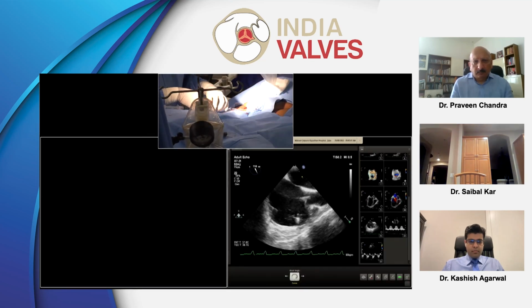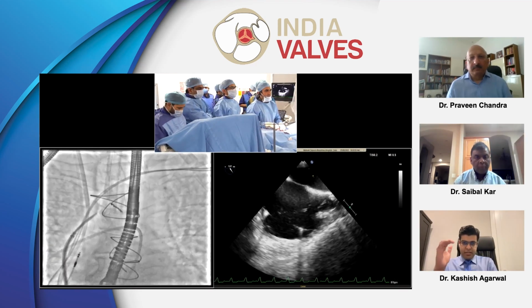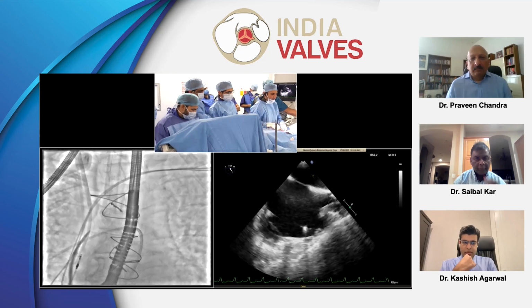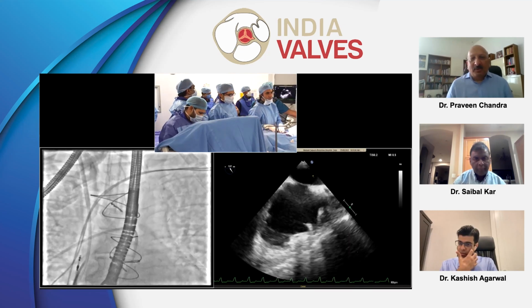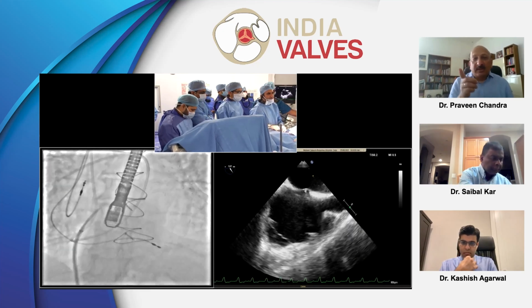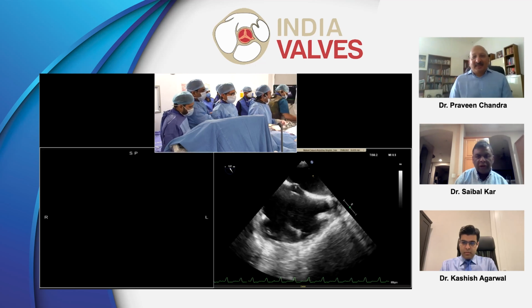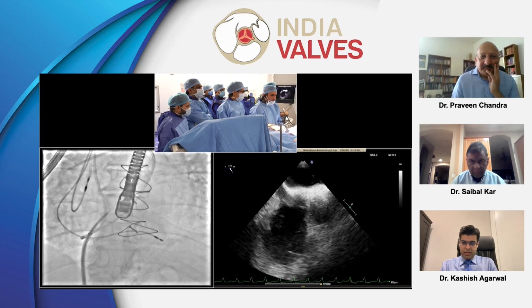And in my practice, where we use Baylis, the dilator bends, like the way you bend the needle. So I just bend the dilator more. So I'm going to come down. I'm clocking and I'm coming down. The only thing is with the Bovie cut 30, or maybe you can take 35. We do that for the transcaval also. Can you remove this Swan, please? That's great.